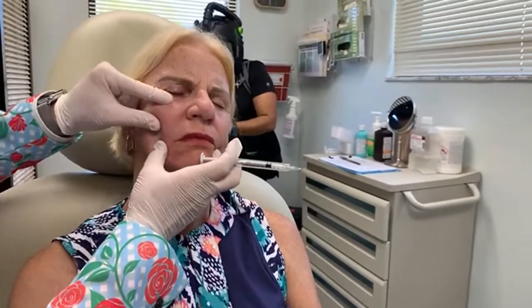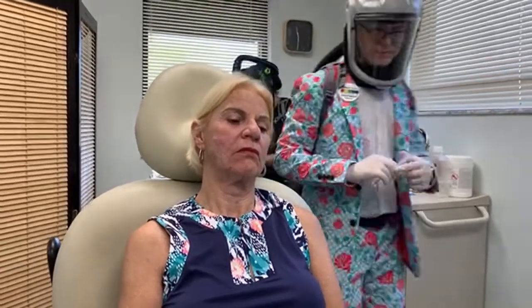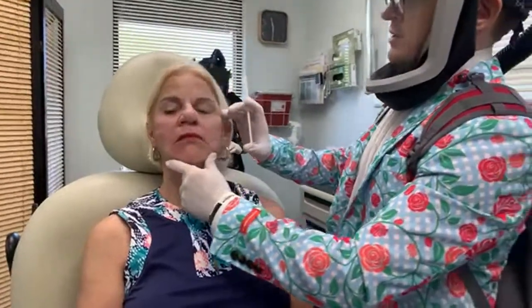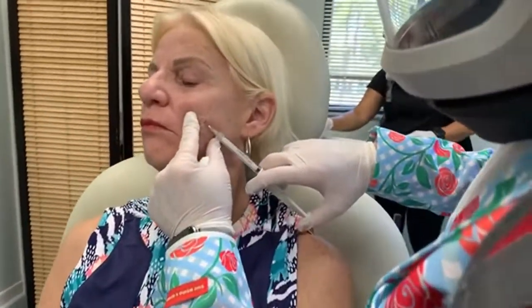I like to recommend that 5-minute massage 5 times a day for 5 days. That I do myself? Correct. And I'll show you how. You cannot hurt the product. Let me turn your head this way, so you can see these areas clumping out a little bit.